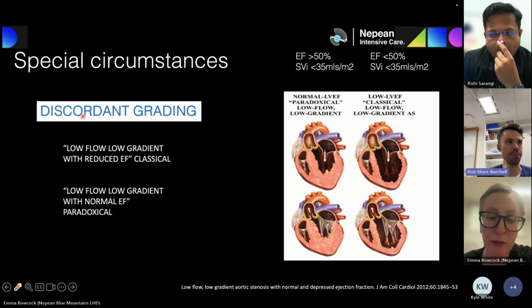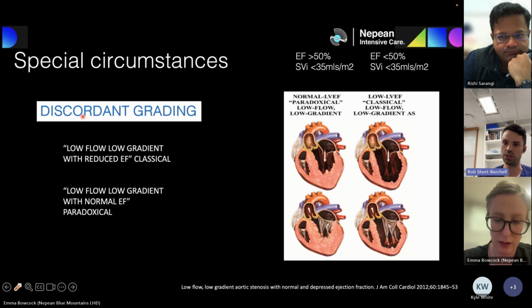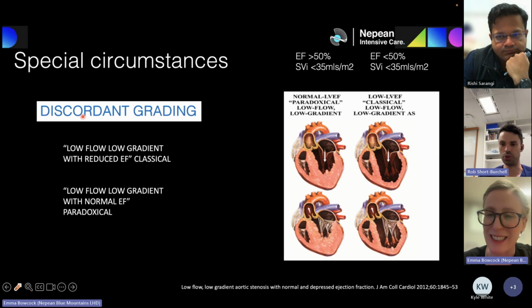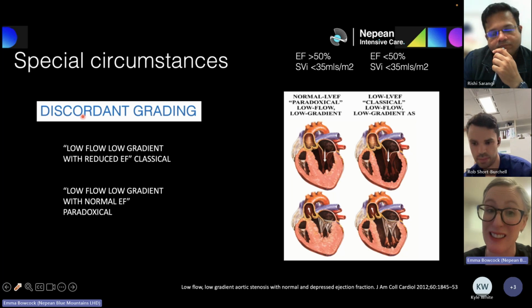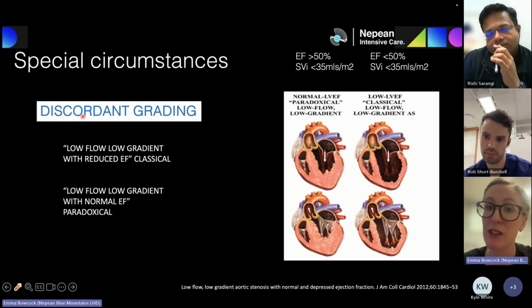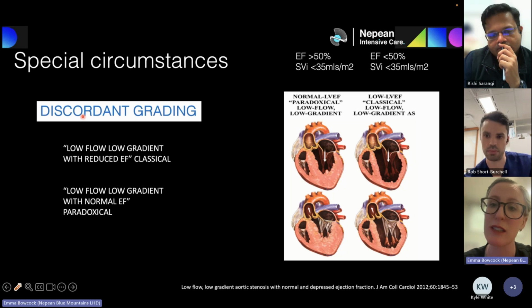I have a follow-up question. If they're in atrial fibrillation and have pulse pressure variation, is there a way of overcoming that? I know the cardiac anaesthetists like to do the continuous wave Doppler and then just trace out the denser profile as their LVOT VTI. What's your feeling about that? Nah, I wouldn't do that. It's not recommended, and everyone I've spoken to about doing that would caution against it. Probably why you would do it is because when you're in the middle of a case, it's super easy to do, right? So why not? But you shouldn't. That shouldn't be your default. It's not good practice.